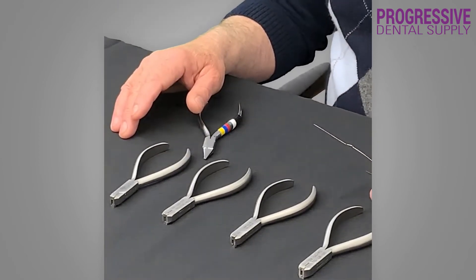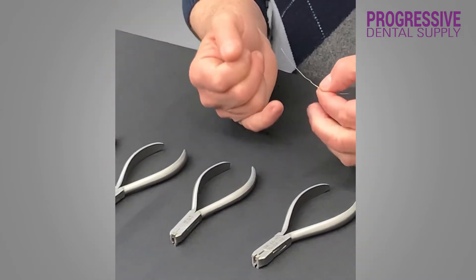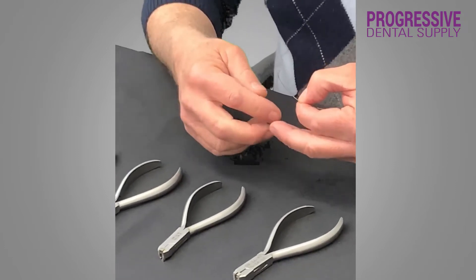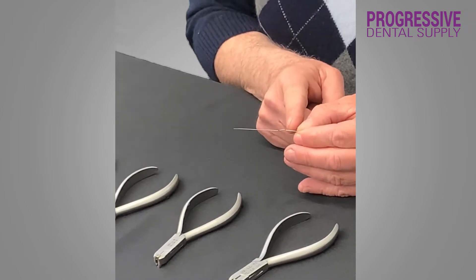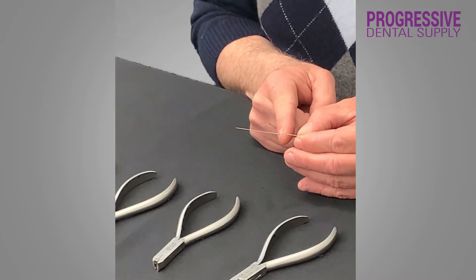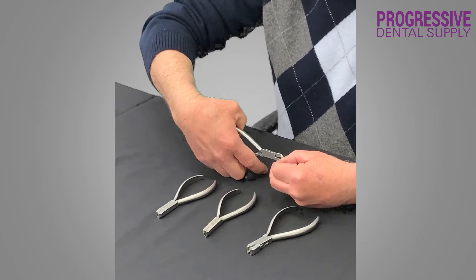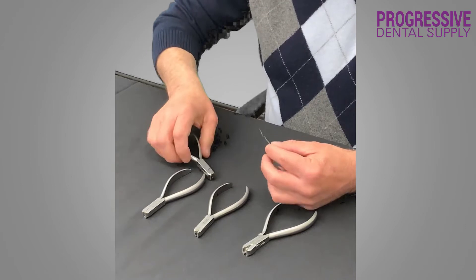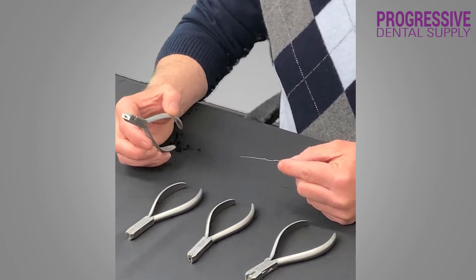How simple will it be to make the same bend with the finishing pliers I have designed? This would give me, if it was a lower arch on the right, a mesial root tip with the mesial marginal ridge going up and the distal marginal ridge staying at the same level. Grabbing the wire, putting the plier on top of the wire, and just giving it a full squeeze. And as you can see, putting the bend with the finishing plier took about three seconds.